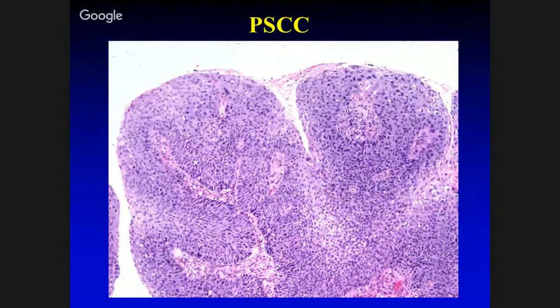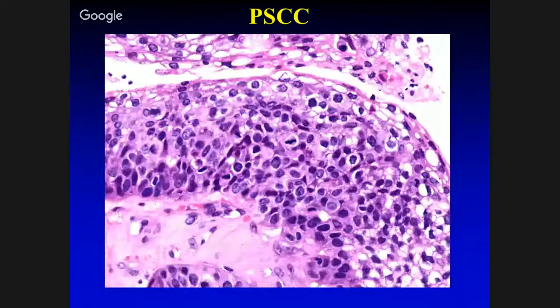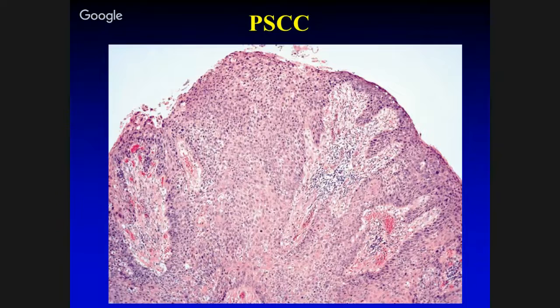And you can see everything is dysplastic. So this is essentially carcinoma in situ with a papillary architecture, except that with this diagnosis, by definition, there is an indication that even if you don't find invasion, it's considered at least superficially invasive. Diffusely P16 positive and molecular analysis positive.